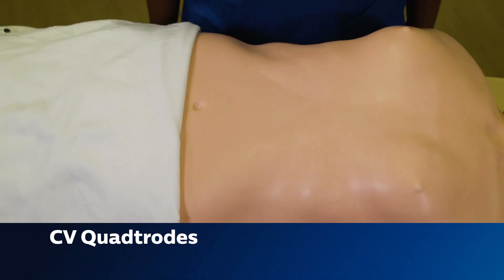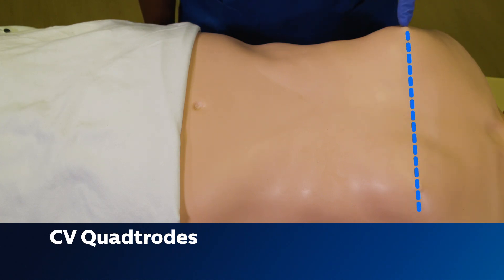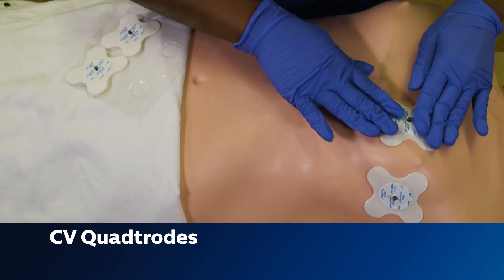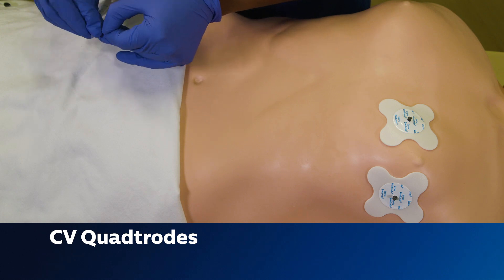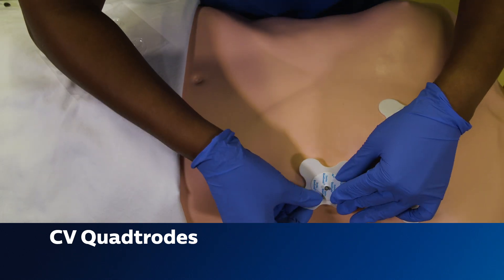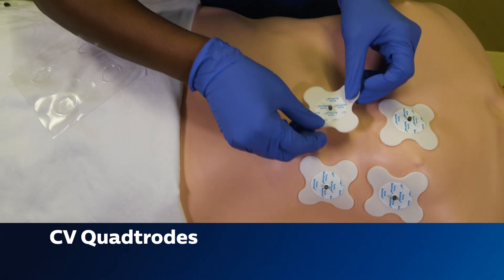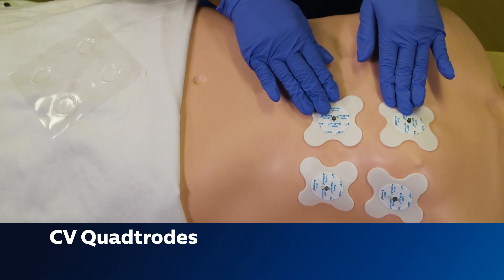When placing the CV quatrodes, go to the imaginary nipple line at the fourth intercostal space and place two on either side of the nipple. Then place the other two below on the lower half. All of them will be to the left of the sternum — do not center them on the chest. If the patient has a large breast, the lower two quatrodes go under the breast tissue, not over it.